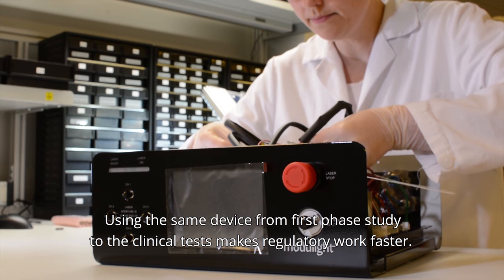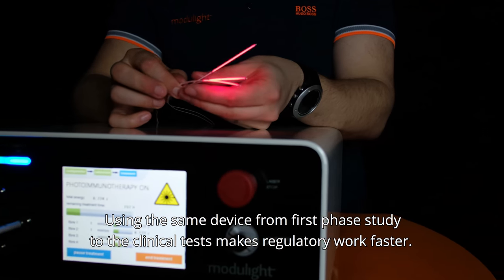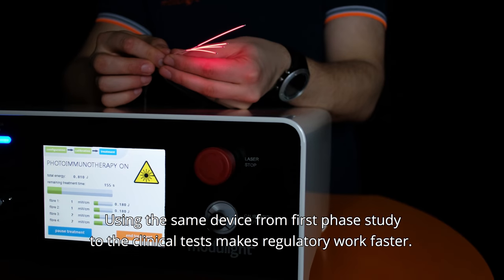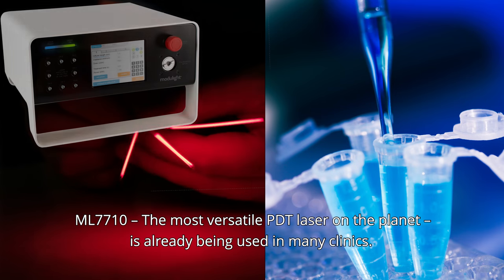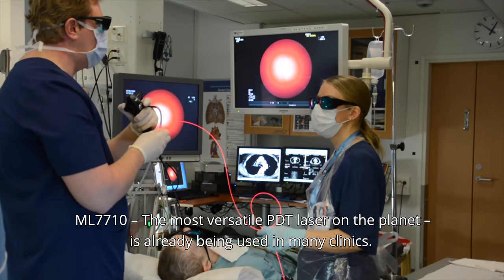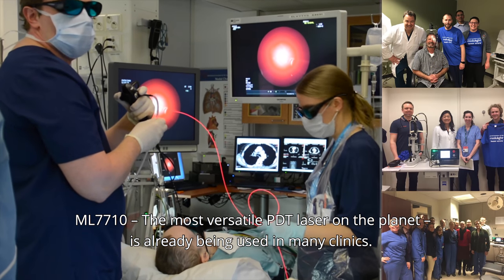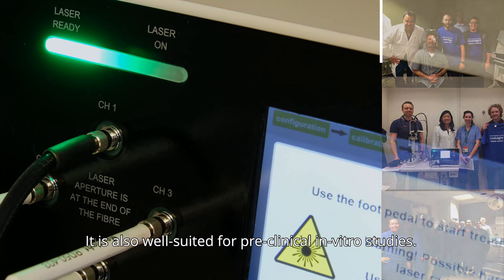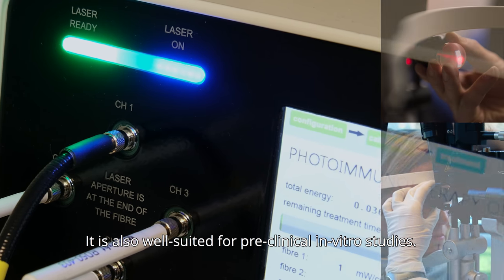Using the same device from first phase study to the clinical tests makes the regulatory work faster. The ML-7710, the most versatile PDT laser on the planet, is already being used in many clinics. It is also well suited for pre-clinical in vitro studies.